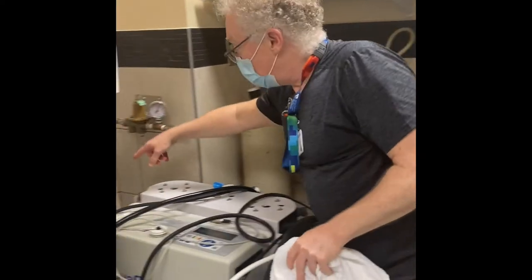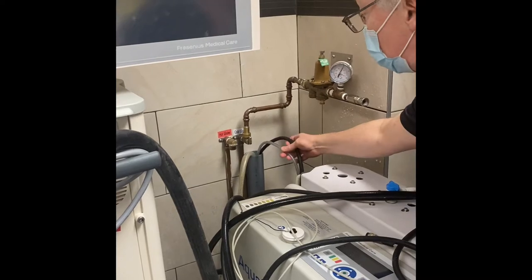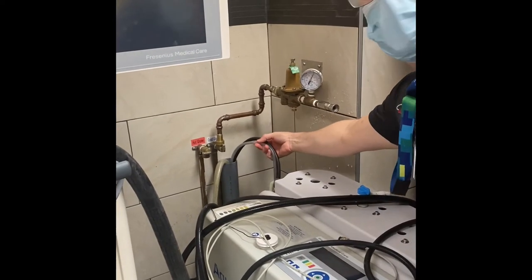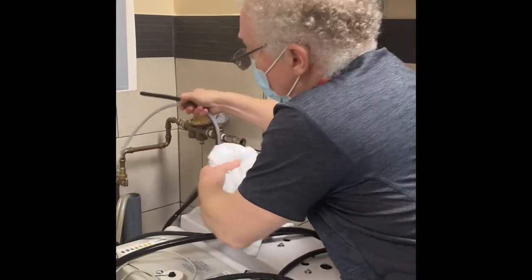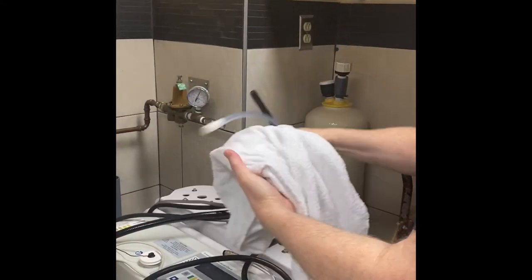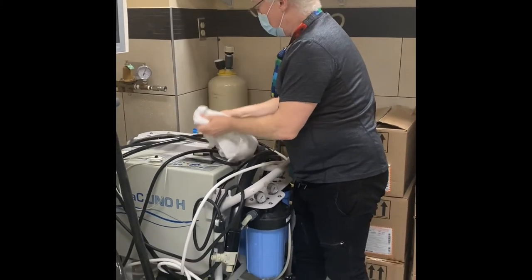To disconnect the drains, you have two drainage hoses — the black one and the clear one. Just pull those out. And the machine is ready to move.